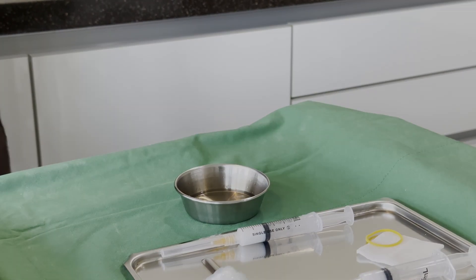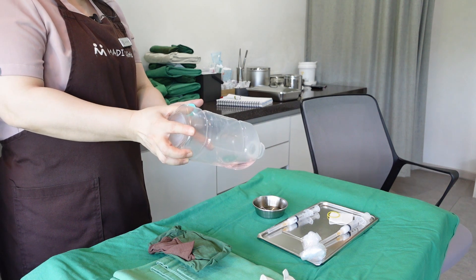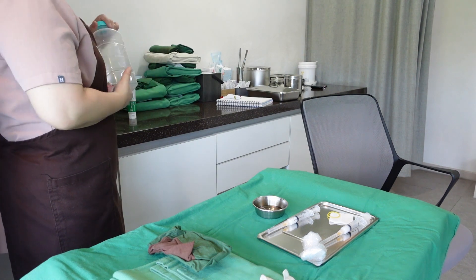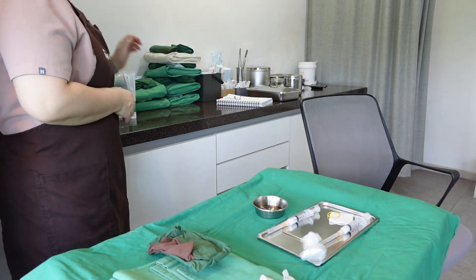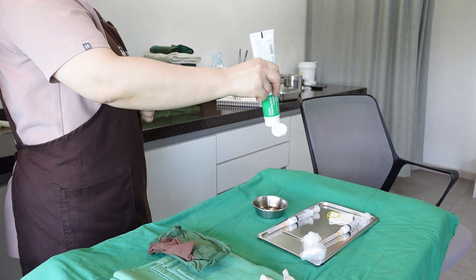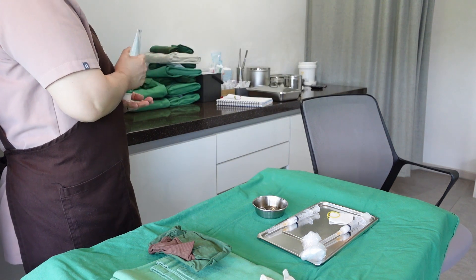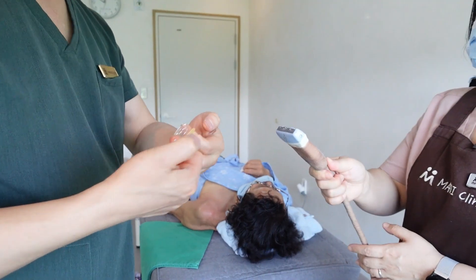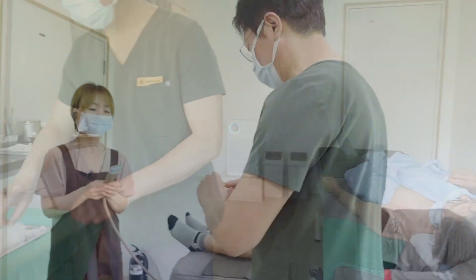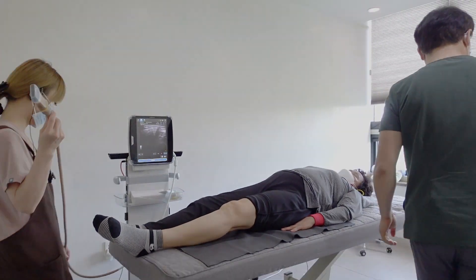When it's time for the ultrasound procedure, carefully pour the premixed chlorhexidine and medical alcohol solution into a sterile bowl on the surgical dressing table. Then gradually add chlorhexidine gel to the liquid mixture, adjusting the amount to achieve the ideal consistency for optimal ultrasound scanning. It is essential to protect the ultrasound probe from potential damage caused by the strong alcohol content in the aseptic gel, so use a rubber ultrasound probe cover that safeguards the probe's rubber components from erosion or degradation.